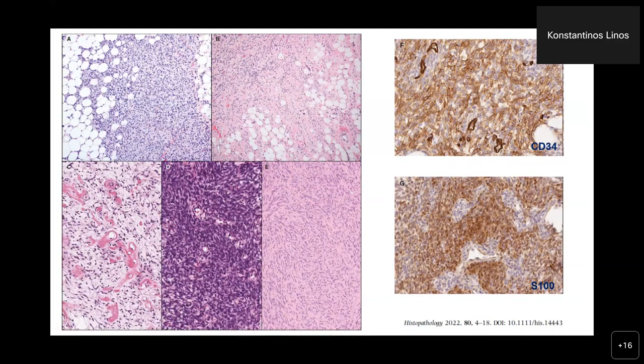So they have a broad histologic spectrum. They can look from benign to intermediate malignancy to fully malignant. And they can be superficial, they can be deep, they can infiltrate the fat, as you see here. They can have this characteristically, but not always. But if you see that, you need to remember that you may be dealing with an NTRK fused mesenchymal neoplasm, this perivascular colonization. Or they can have a fibrosarcoma-like appearance, the more malignant ones, looking like MPNST.